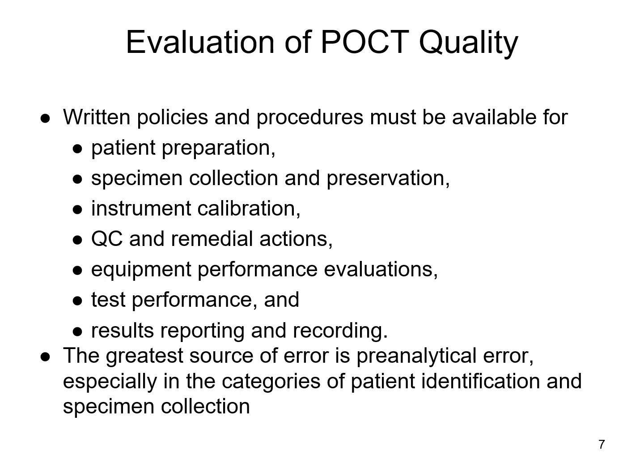How to actually do the test and what you're going to do as far as reporting the test and recording those results, or how you report and interpret the test. So these are things that they do require that you have in the procedure. While you can refer to manufacturer procedures, they're not your overall procedure. You must have something set up for your laboratory specifically.